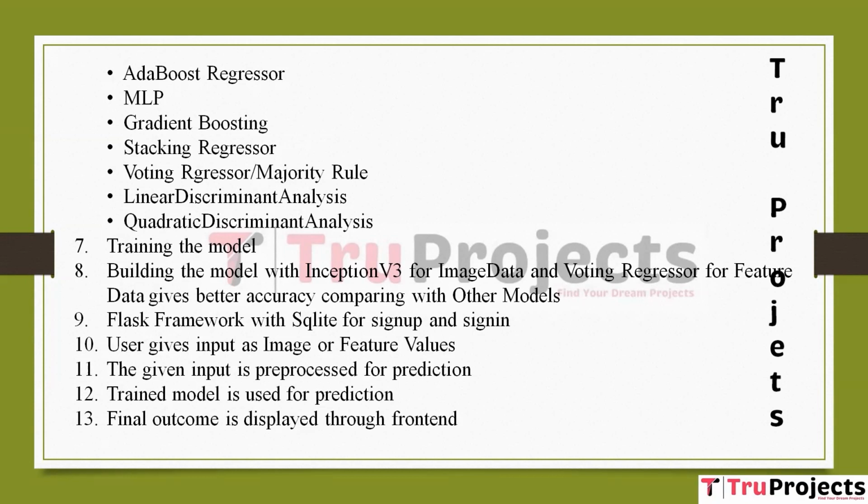Stacking regressor. Stacking is an ensemble learning method that combines the predictions of multiple base models to create a final predictor. It's employed to improve the predictive performance and robustness of sleep apnea detection models. Voting regressor or majority rule. Voting regressor is an ensemble method that combines the predictions of multiple regression models by averaging or taking the majority vote. It helps in aggregating predictions from different models to improve accuracy.